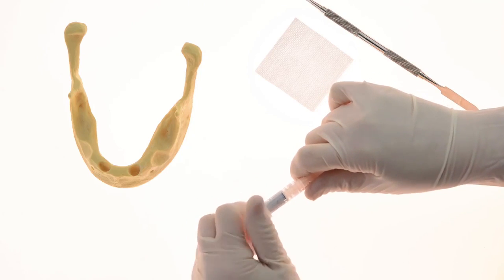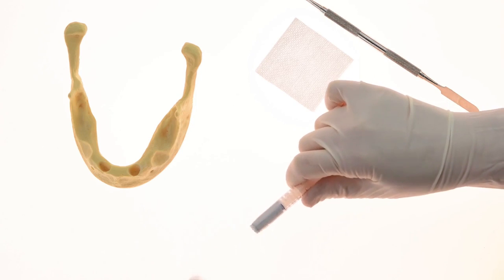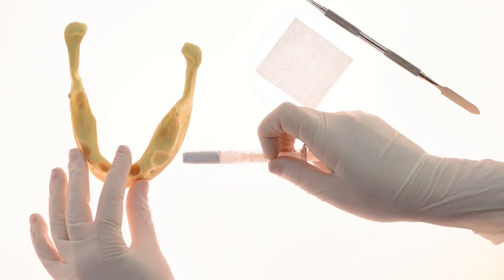Remove the cap by twisting and pulling it out. The workflow should be consecutive and shouldn't exceed the cement working time.